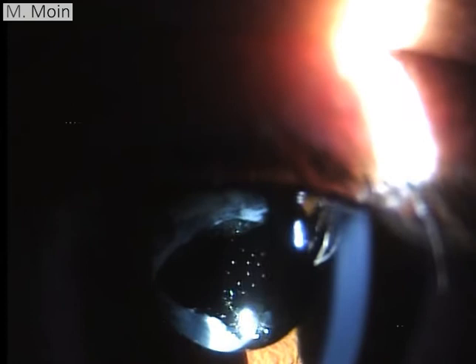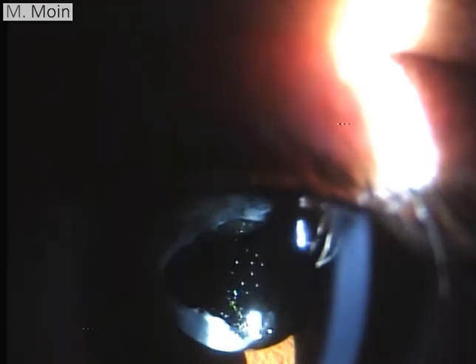Welcome to this video in which we are going to show you a patient who is pseudophakic. You can see this is the bright shining reflex from the slit lamp bulb shining over here.